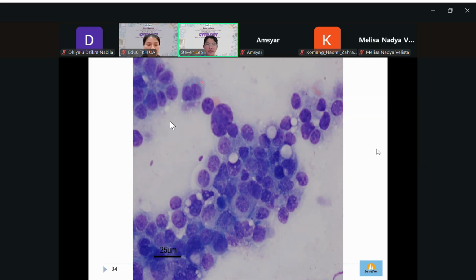And especially if you still remember the histology, you can see this is a typical acinar structure of the epithelium. You can see it beautifully on the edge. It's typical of epithelial origin. It's good.